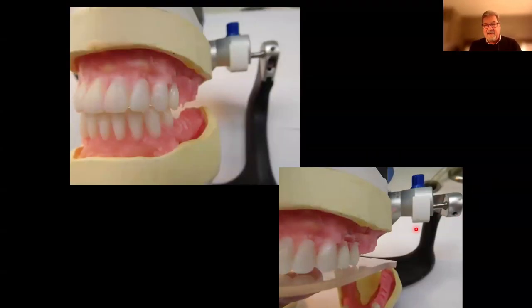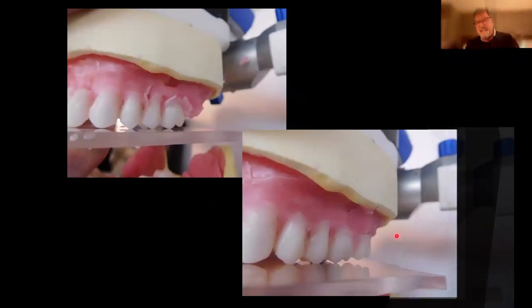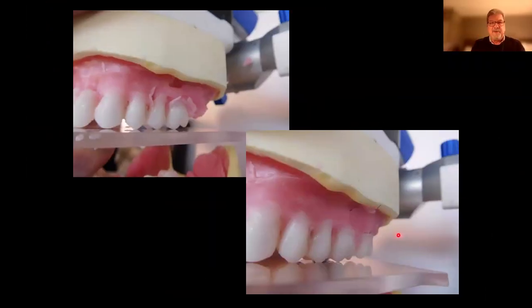And what I'll do, I have contact on the first two bicuspids, and when I get to the first molar, I want to have the mesial contact on the first molar and distally off the occlusal plate. And then the second molar, I'm going to have totally off the plate up until the mesial part of the second molar.